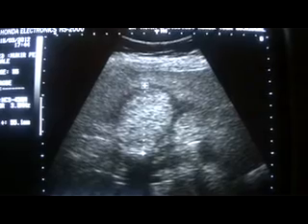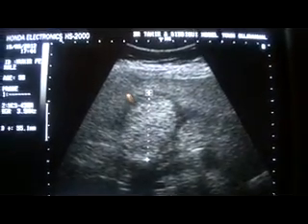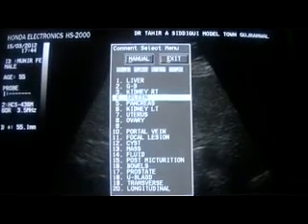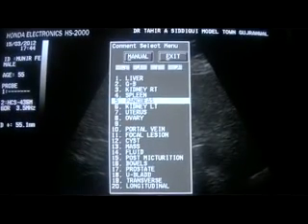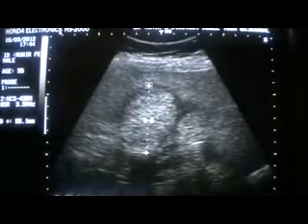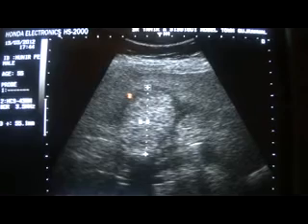So this gallbladder is, you will report your finding as I have narrated, and do give a caution point that the possibility of any aggressive pathology cannot be ruled out, for which we need further investigation.